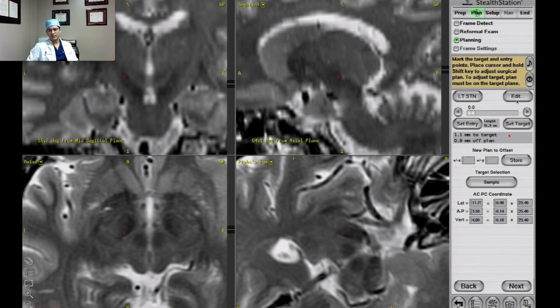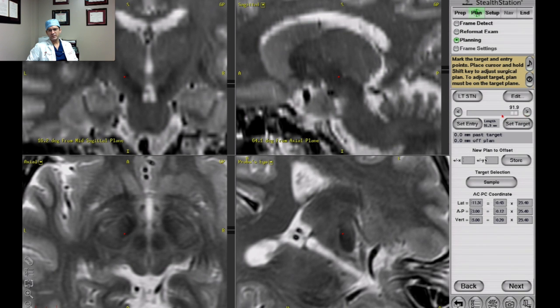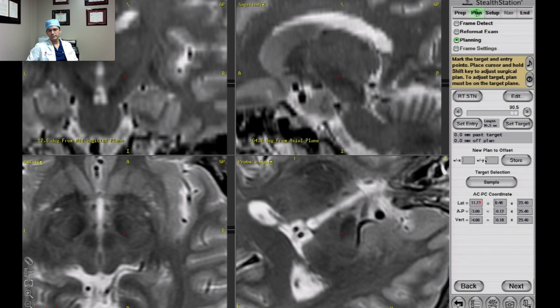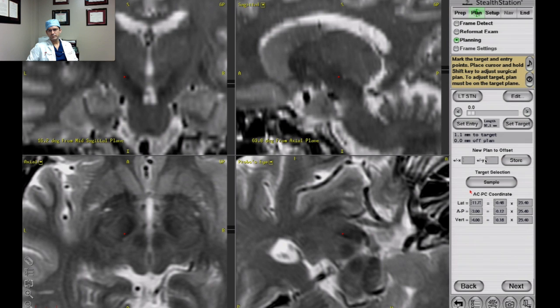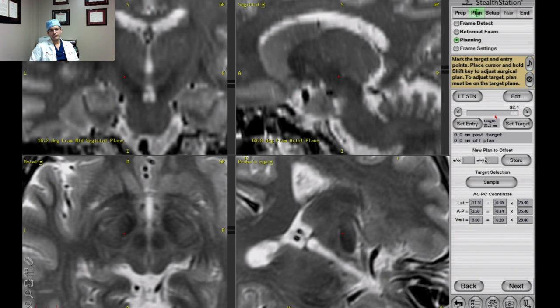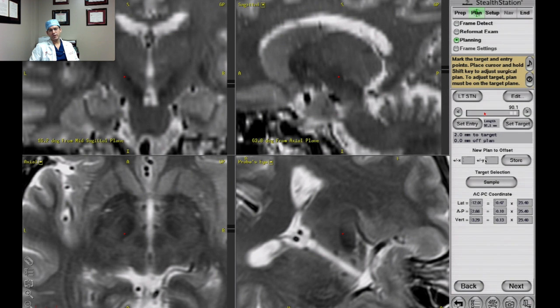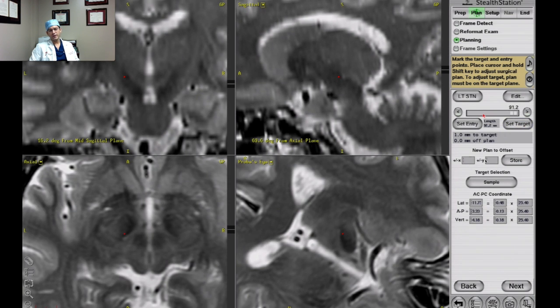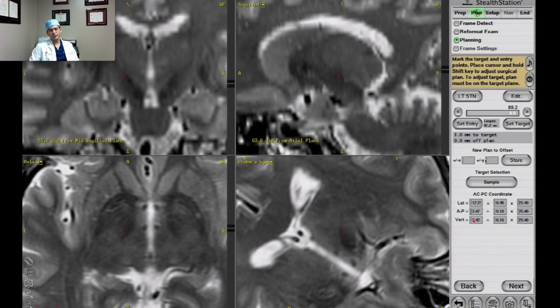I'm at a new spot, and I checked to see where I am relative to my pre-existing plan. All this is just fine-tuning. In the back of my head I'm taking into account: if I end up with a 1.1-millimeter posterior-medial deflection, will I be happy with that position as well? In this case, we combined doing the operation under general anesthesia but also used microelectric recording, and we had good recordings to match the anatomy. That can be done with a propofol drip where the anesthesiologist — in my OR — will use a quarter percent MAC.